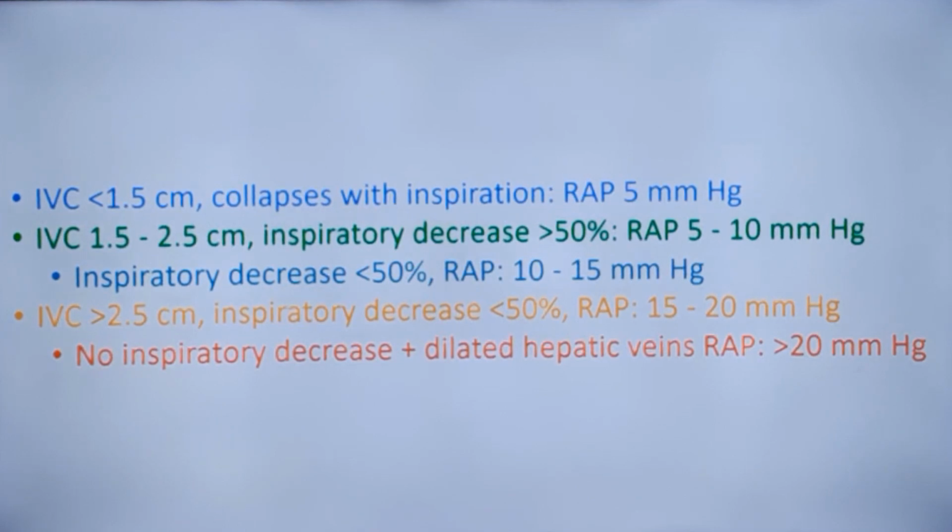While estimating right ventricular systolic pressure or RVSP from the tricuspid regurgitation gradient, usually we add 10 millimeters of mercury to the observed tricuspid regurgitation gradient to get the estimated right ventricular systolic pressure or RVSP. But this nominal 10 may not always be correct.